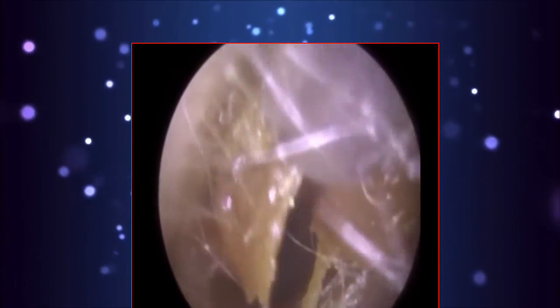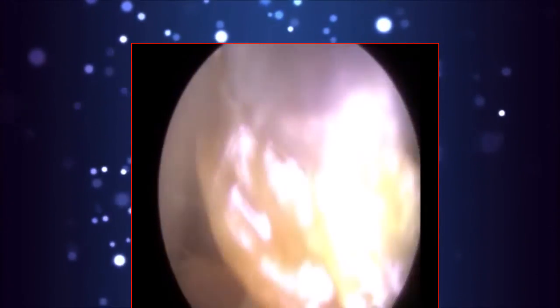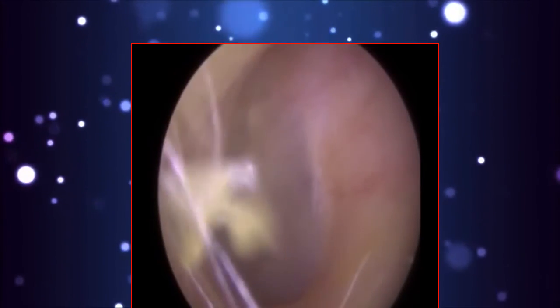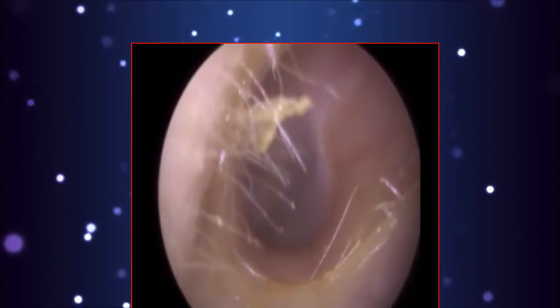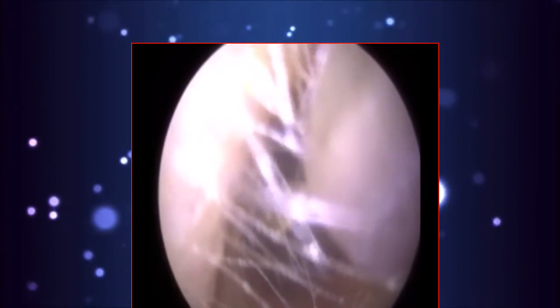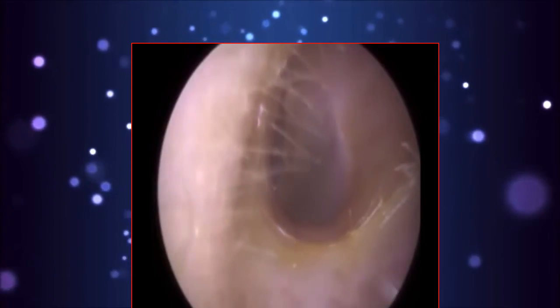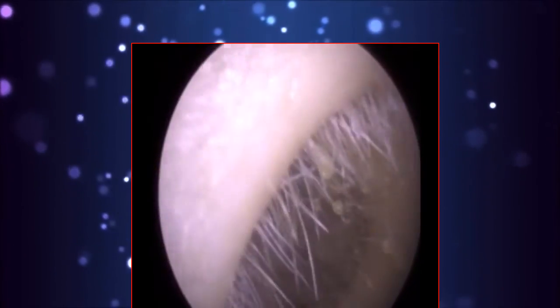So this is the patient's right ear. Patient had been using some drops, so it came up really quickly and easily. Been using some olive oil drops, I believe, some dead keratin there. I'm just going to mop up, and again, lovely healthy eardrum. And then we're going to switch to the left side.